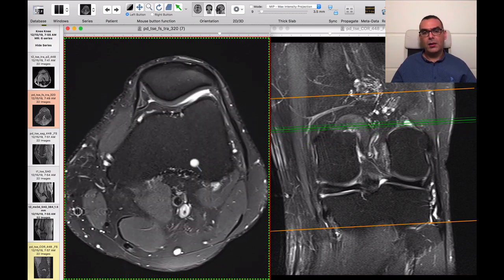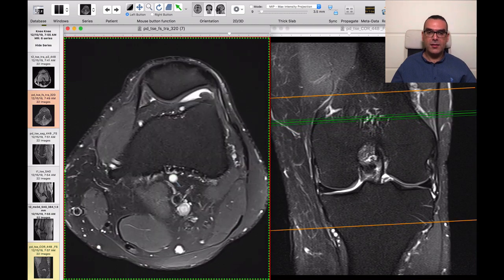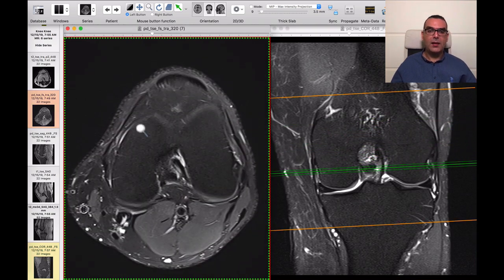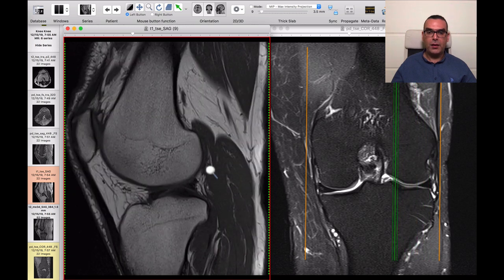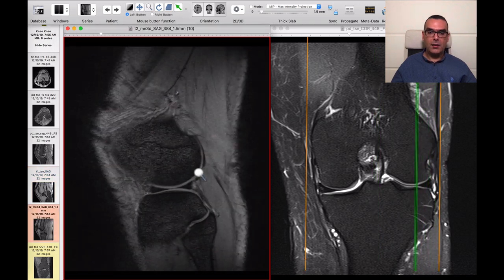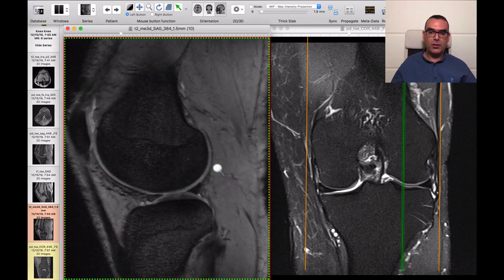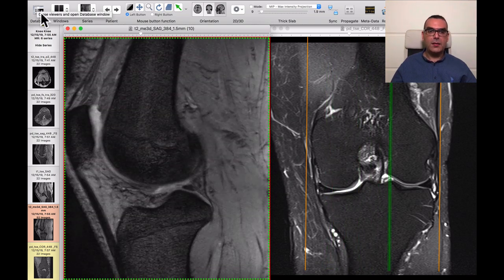This is a very common scenario — a middle-aged man or woman with vague knee pain sent for MRI, and you find mild degeneration or minimal joint effusion, a small Baker's cyst. That's it. You report mild degeneration of the posterior medial meniscus with no definite tears, the minimal effusion, and the Baker's cyst. On the T1 there is no mucoid degeneration, ACL is intact, no fracture or fissure. The volumetric gradient sequence confirms the articular cartilage is intact.